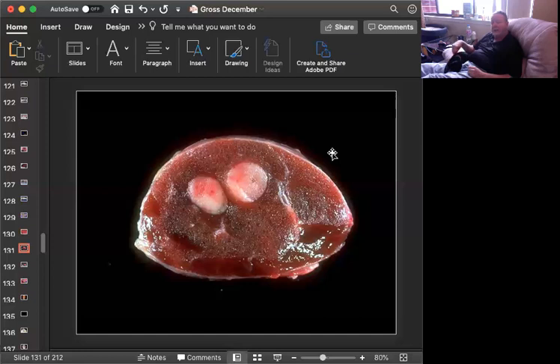But they do light up for C-cell tumors. They are synaptophysin positive. You know, it probably doesn't make any difference. They don't do anything, but it just shows you that some of the older literature can be wrong and not to believe everything that you read. So I routinely run immunohistochemistry on this, and I have a lot more C-cell tumors now than I did in the past. So run it yourself. Don't believe me. Don't believe anything I say. Run it yourself, and then you let me know if you come out with more follicular or thyroglobulin positive cells than C cells.